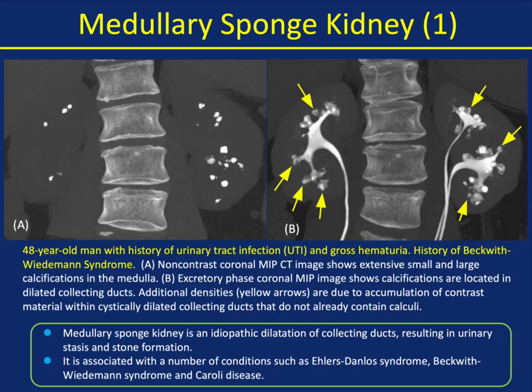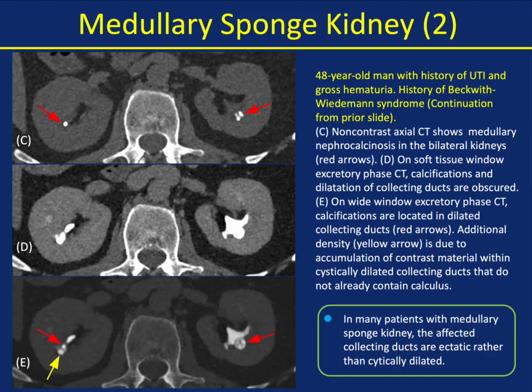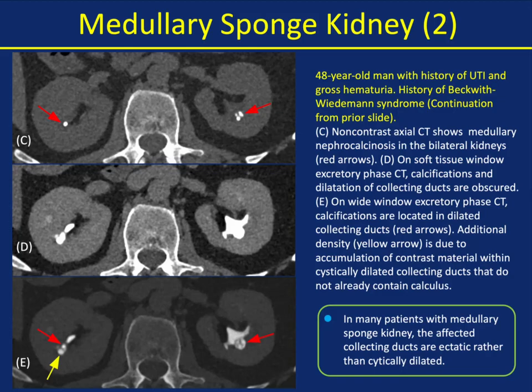Medullary sponge kidney is an idiopathic dilatation of collecting ducts resulting in urinary stasis and stone formation. It's associated with conditions like Ehlers-Danlos, Beckwith-Wiedemann syndrome, and Caroli's disease. Another example: a patient with a history of UTI and gross hematuria. The non-contrast scans show medullary nephrocalcinosis. On soft tissue window, you don't appreciate the change at the interface of the calyces and the stone — the stones look hidden — but with wide windowing you very nicely see the calcifications in the dilated collecting ducts. It should be noted that in many patients with medullary sponge kidney, the affected collecting ducts are ectatic rather than cystically dilated.